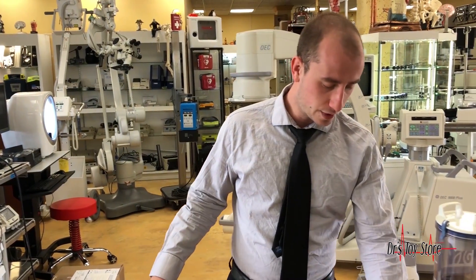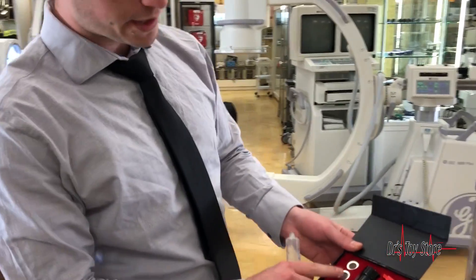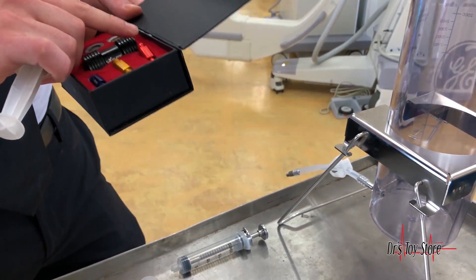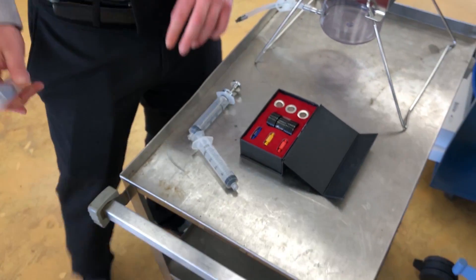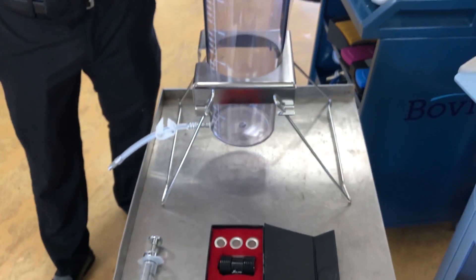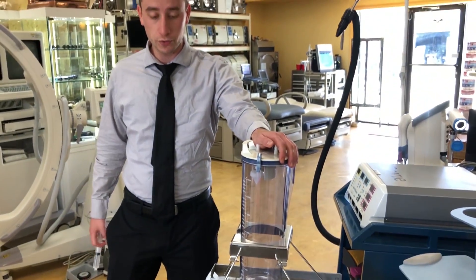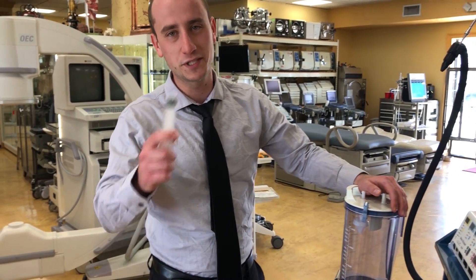Fat has stem cells, so instead of using Botox and all these fillers, you can use the person's own fat — which lasts a lot longer, is a lot more viable, and is natural. You would use this system to break down the fat. This whole system sells for $4.95 and is fully autoclavable. We have vacuum syringes, cannulas, and autoclavable canisters for fat reinjection and fat transferring. Give us a call at 877-DRS-TOYS today.